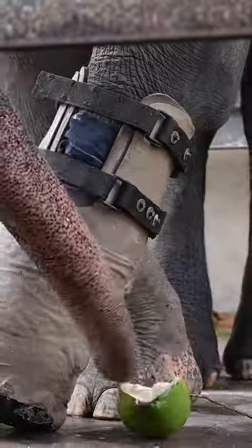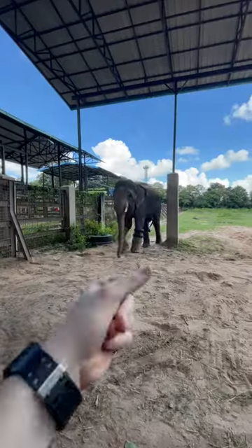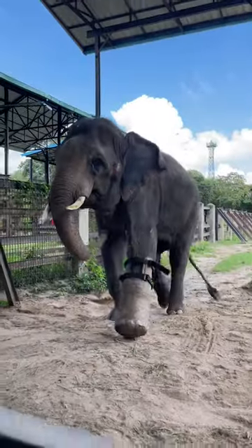He's given a juicy coconut as a reward and there you have it, a prosthetic foot for Chuk the Asian Elephant — now he's able to walk, run and swim freely without any pain.